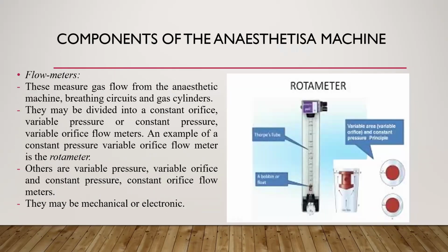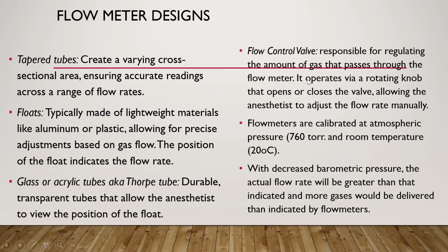And this is important because if you do not take care of it at higher altitude, and you think you are still giving maybe 2 liters per minute, the actual flow is greater than that.